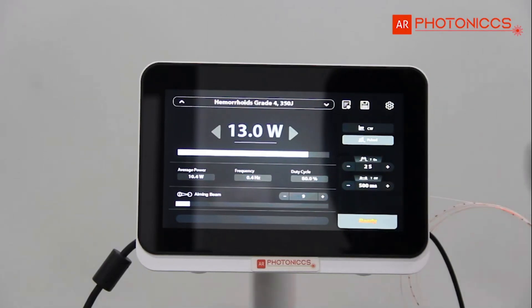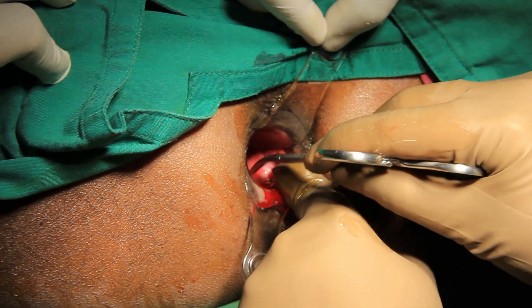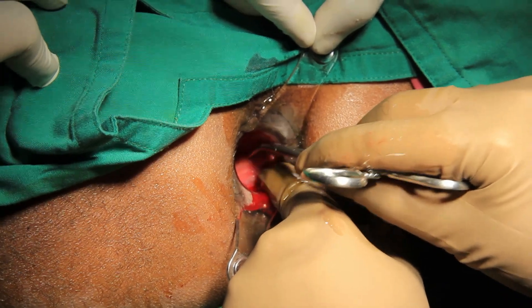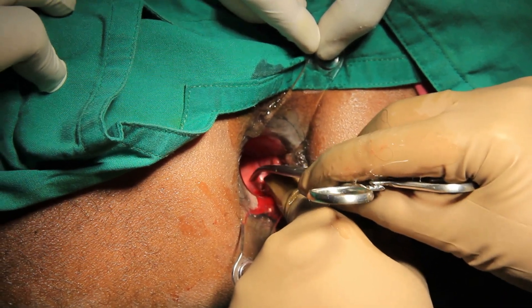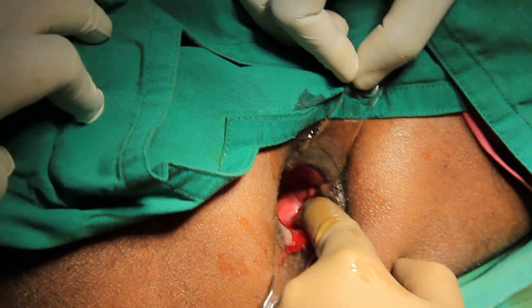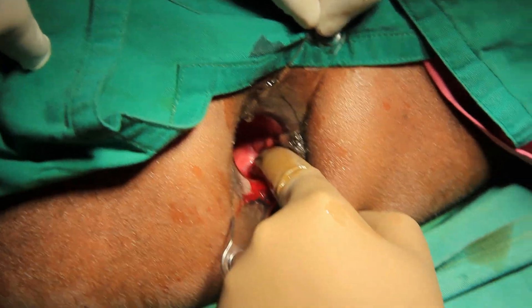This is the setting we use for laser-induced de-arteralization of the hemorrhoids. I shall locate with the help of Doppler each and every artery and obliterate it with the help of laser. The laser is kept at 13-watt setting with 2-second pulse and 500 milliseconds pause.